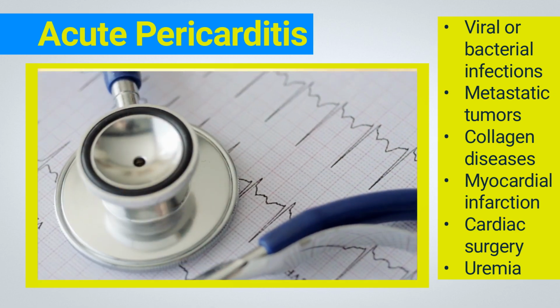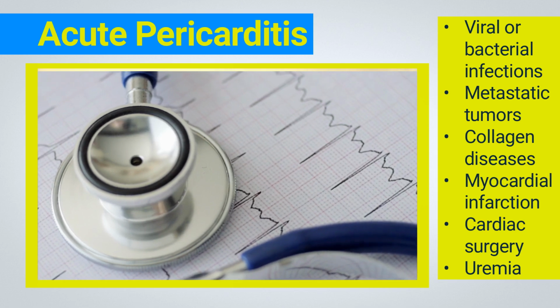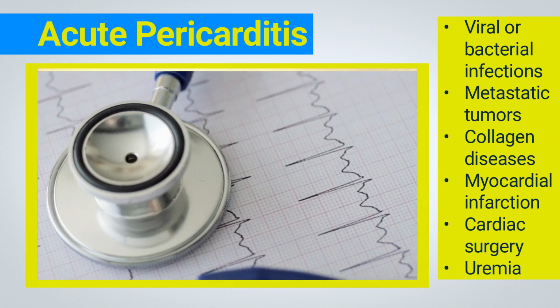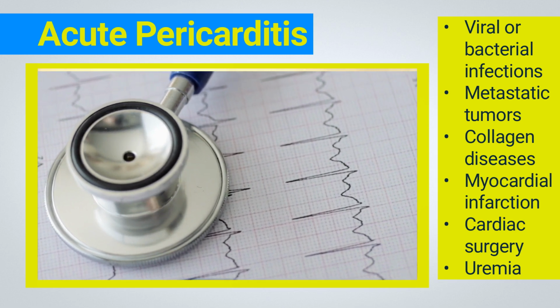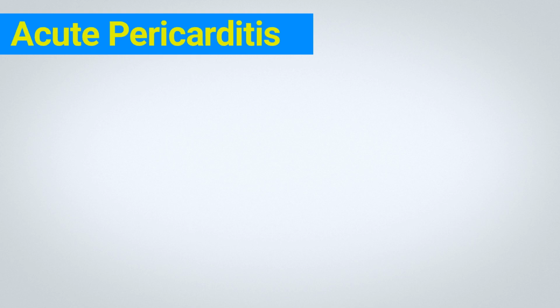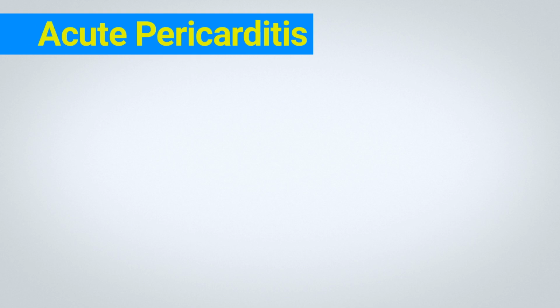Diagnosis is generally made on the basis of clinical findings, though additional tools such as electrocardiography, chest X-ray, and blood tests can be used to support the diagnosis and rule out other conditions. ECG patterns of pericarditis can closely mimic those found in cases of acute myocardial infarction.